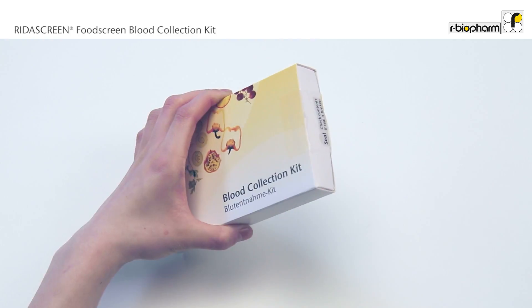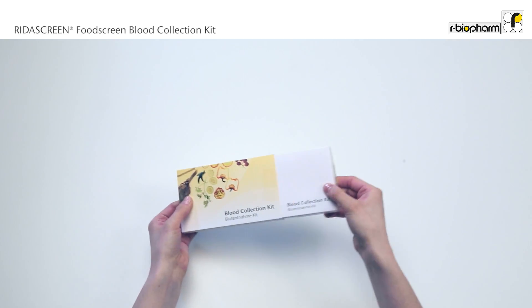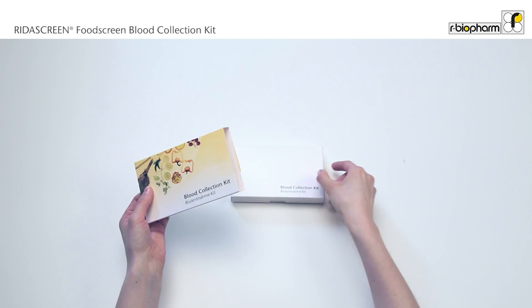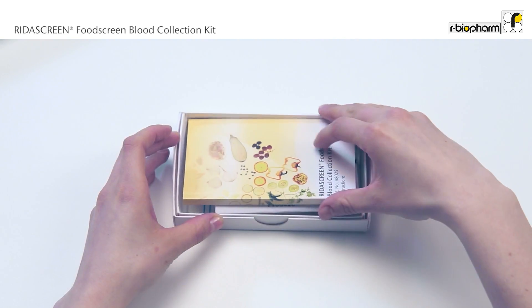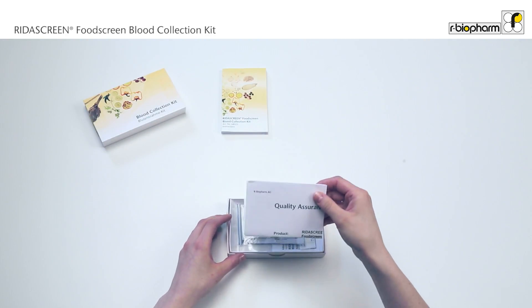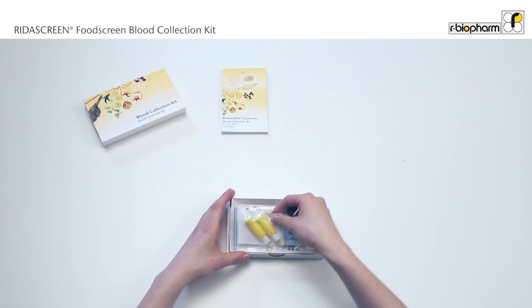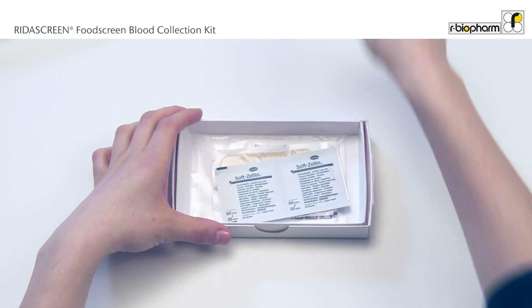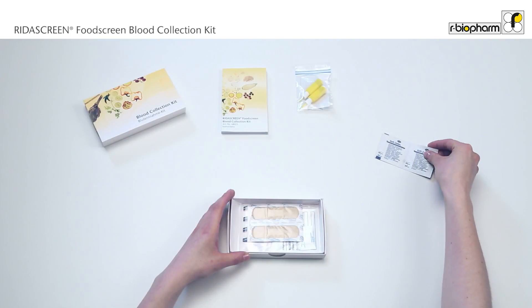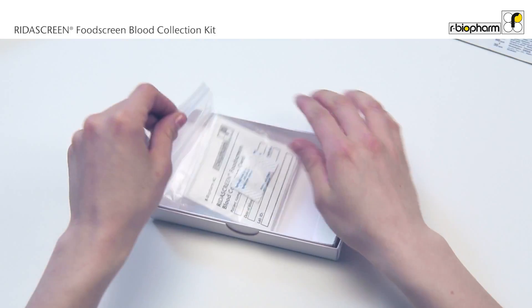Open the kit and check the contents. Please note the outer packaging of the kit might look different. The following items are included: instructions for use, certificate, sterile lancets, sterile alcohol swabs, sterile bandages, reader screen, food screen.